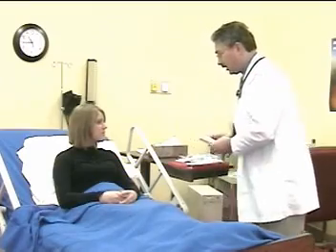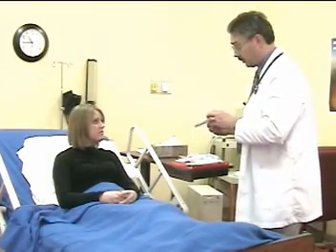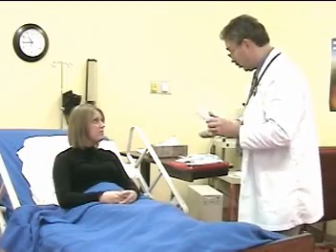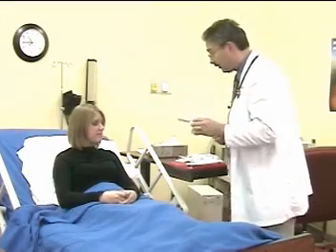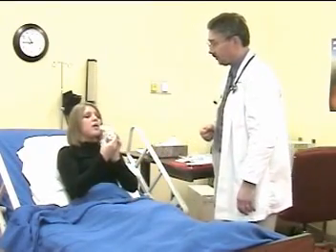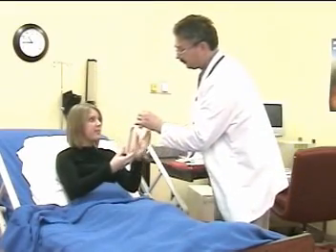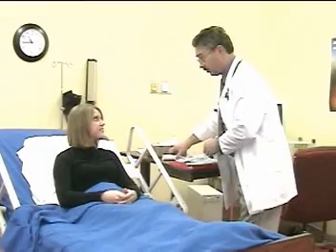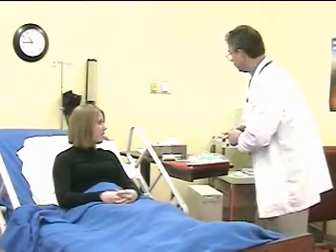Now before we start, I know you're a little bit short of breath, so I do want to make sure that we get a good peak flow measurement. What I want you to do is take in a great big deep breath and blast it out as hard and fast as you can. Very good. You're lower than what you should be. The therapist uses the appropriate gas for propellant.